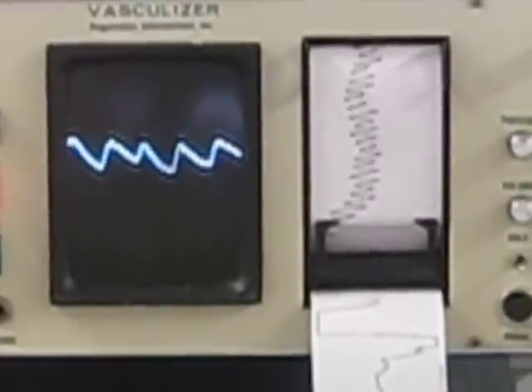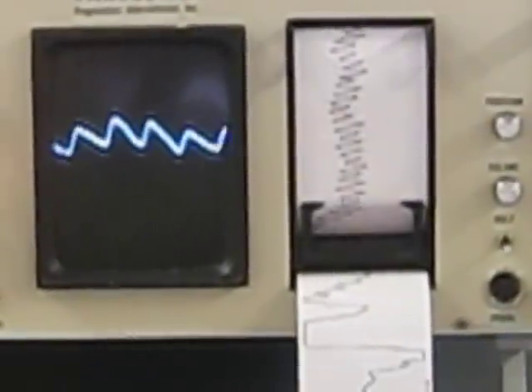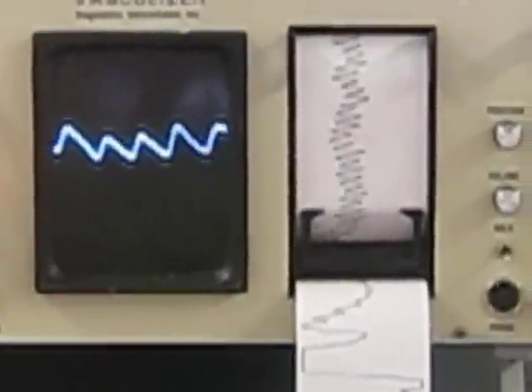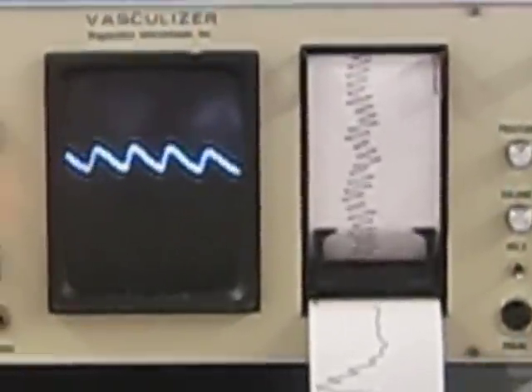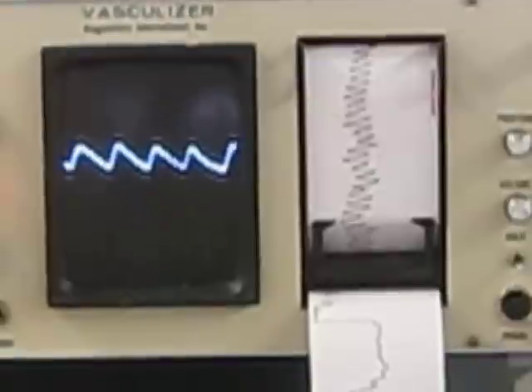Laterally flex your head towards the probe. The wave is fine. We're now in the next position bending it away from the probe. And the wave is fine. Amplitude is good.